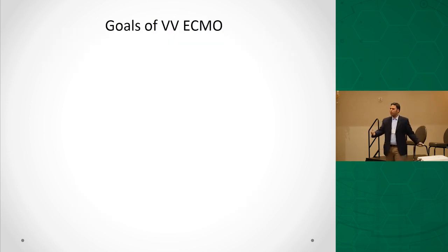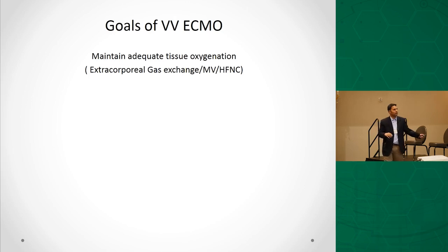So what is the reason I'm showing you all these slides? Especially if you have VV ECMO, the idea is to do these three things: limit your tidal volumes, have optimal PEEP, and reduce your plateau pressure. It's very important to understand that fundamental: we can put everybody on ECMO, but outcomes are heavily dependent on the strategies that we use after deployment of ECMO.